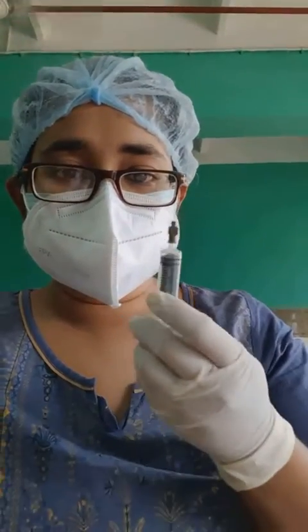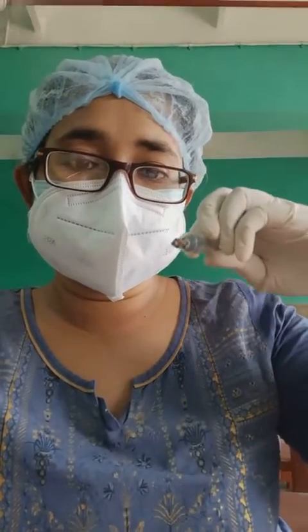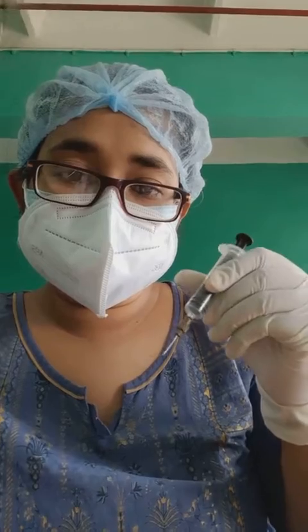This is the AC cannula. It is fitted with a 2 ml, 5 ml, or 10 ml syringe as required. We draw some normal saline into the syringe and put it into the punctum which we have dilated. By knowing the anatomy of the lacrimal apparatus — the canaliculi is first vertical and then horizontal — we first insert it vertically and then horizontally.